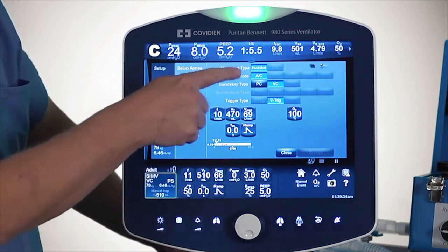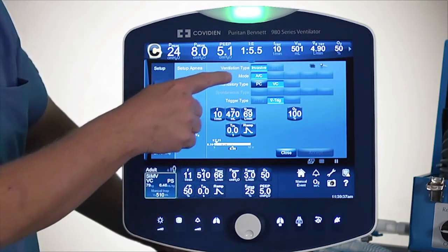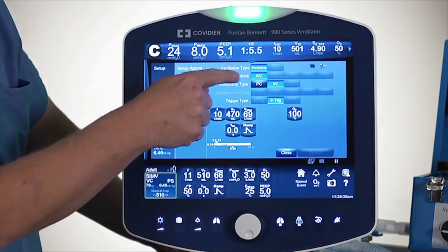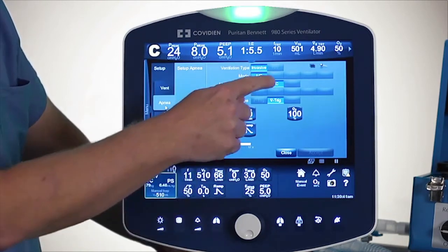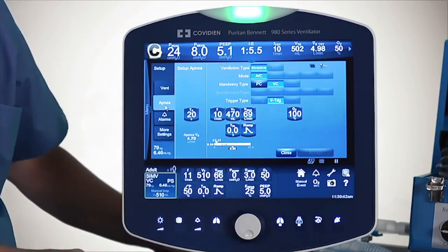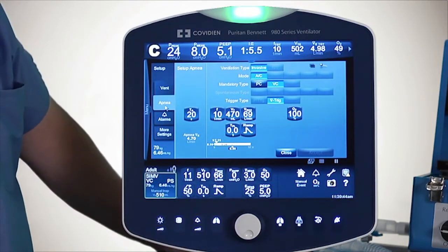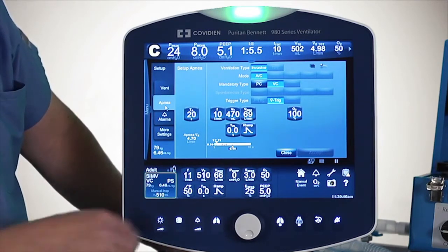Then you will decide what approach you want to use for apnea if it should occur. Right now I've got vent type in blue and the mode is in blue — I'm using volume control, which means that's the active approach to ventilation.